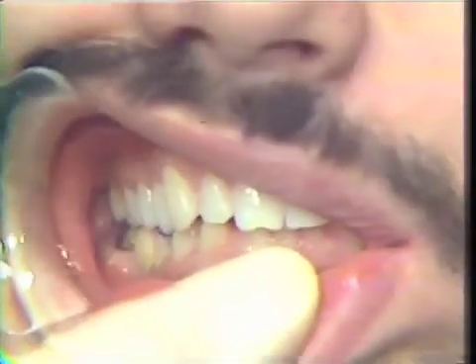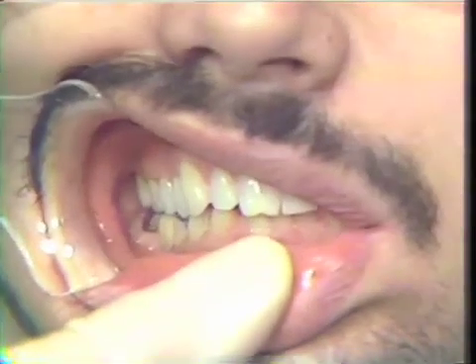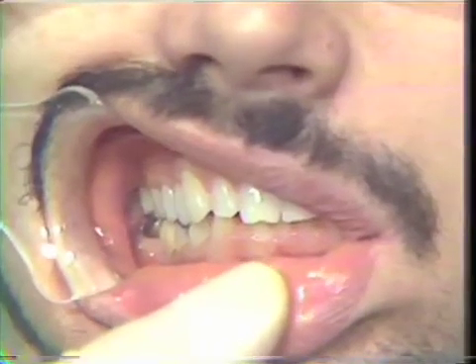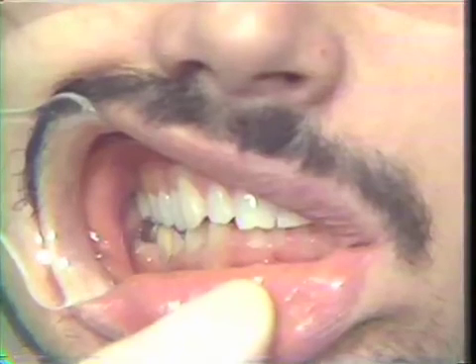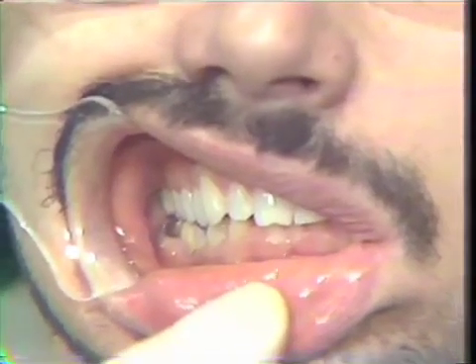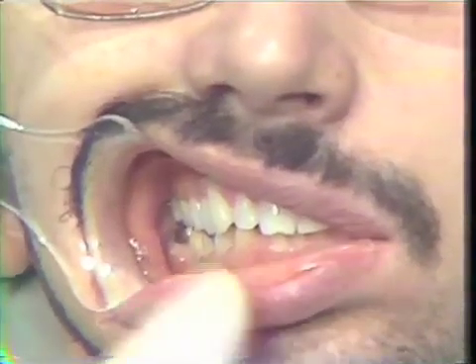Back together again, please. And check our centric relation to be sure that we haven't incorporated any trigger mechanism that might elicit a bruxing action, and cement the bridge in permanently, and then instruct the patient. After a week or so, we'll have him return for a final touch-up and any additional adjustments that might be necessary. And turn your head to the side, please.